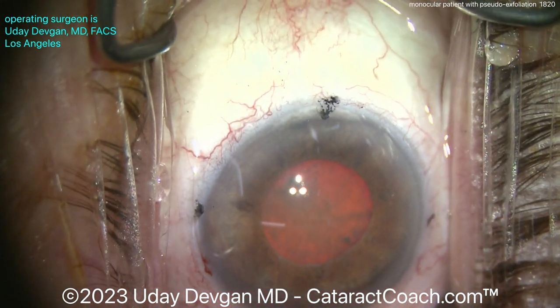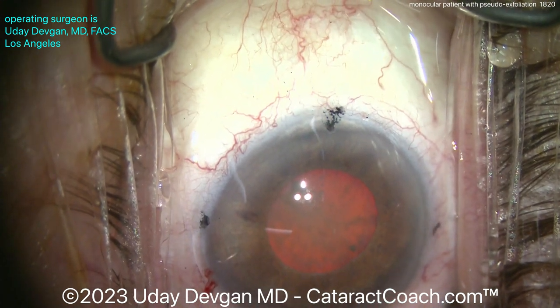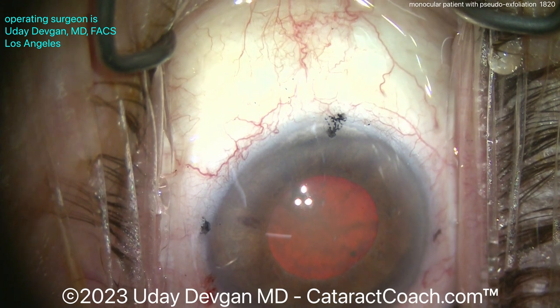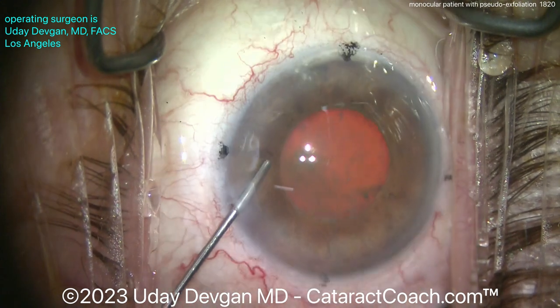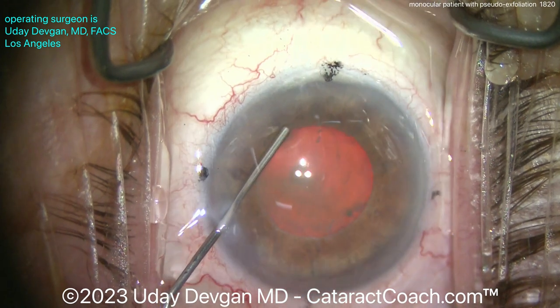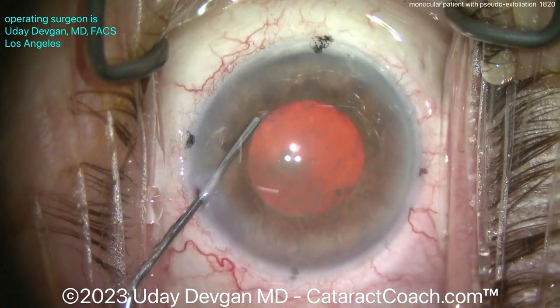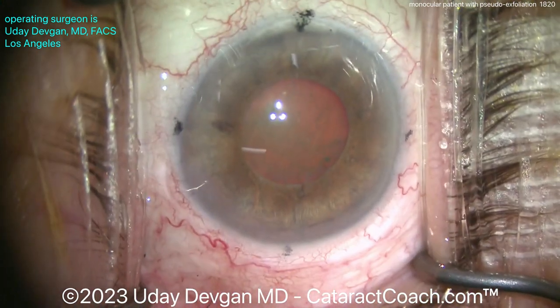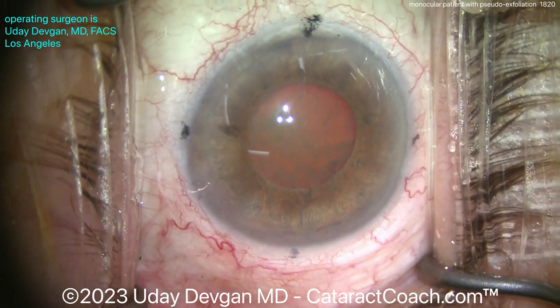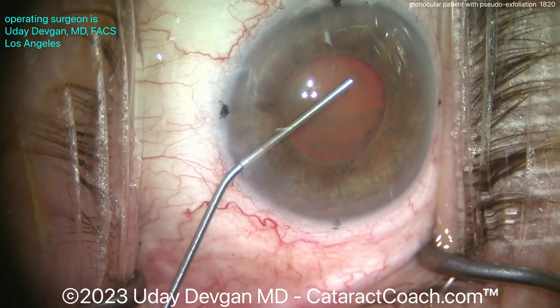You can see as we try to put some anesthetic in the eye, the patient shies away a little bit. This is the maximum dilation with 10% phenylephrine, tropicamide, cyclopentolate — all of the above. The patient also has marks on the cornea for a toric lens; that's a steep axis of about 11 degrees, against-the-rule astigmatism, two diopters. You definitely want to get that toric lens in the eye. The patient is 88 years old, so all ocular structures are delicate.